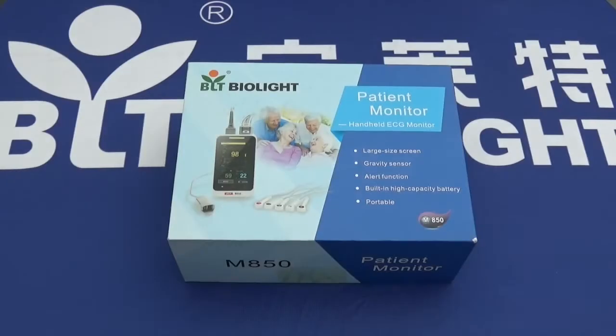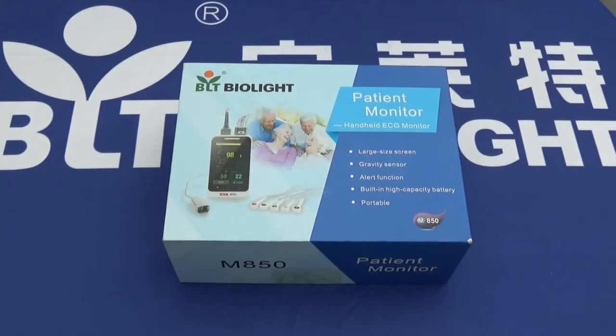Hello and welcome to a brief introduction and unboxing of the Biolight M850 handheld patient monitor. This model comes equipped with ECG monitoring and optional SPO2 monitoring. It features a handheld monitor which is portable and easy to handle. It has a 3.0-inch large TFT touchscreen display, an alarm system, a 4800 milliamp hour 3.7 volt battery, a gravity sensor, and four-direction viewing.